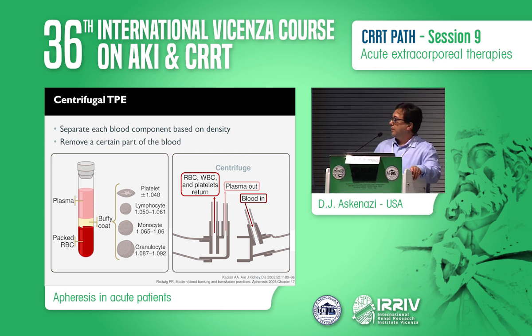There are 2 types of plasmapheresis that you can do. The first I'll talk about is centrifugal TPE. Basically, you get the blood out of the patient's body, you put it into this huge centrifuge, it spins it around real fast and separates the blood so that the red cells are on the outer area and the plasma is on the inner area. You have these little chambers that are like railroad tracks that divert different cell lines to go to the left or to the right. It's essentially based on the gravity that the centrifuge is causing, and separation can be done that way.